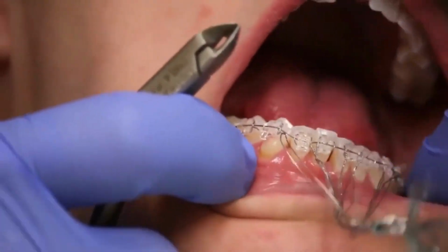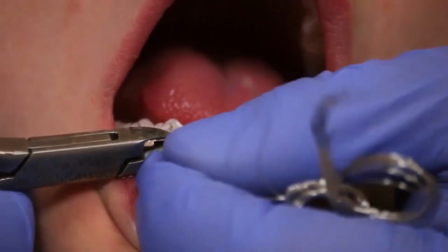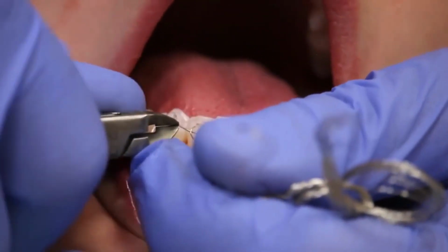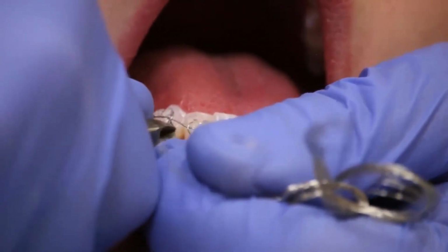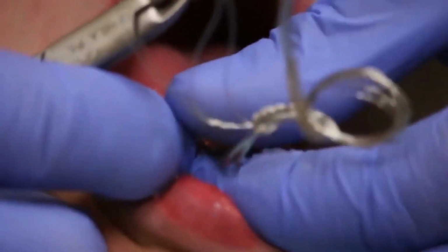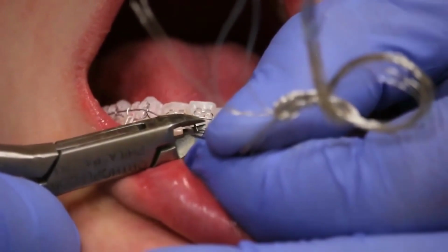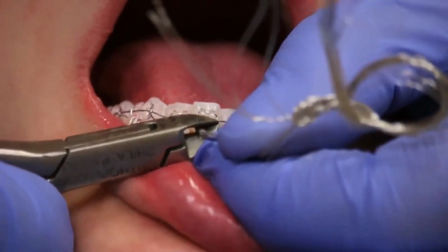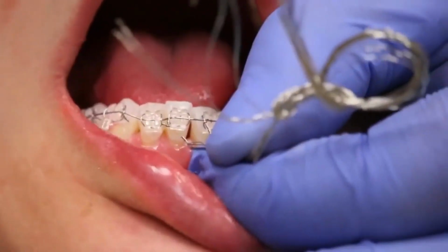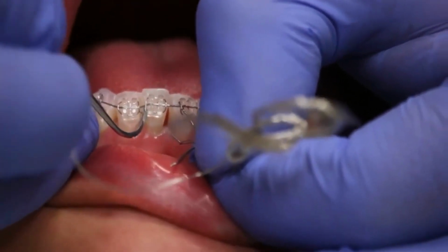Make sure that your pigtail is not very long, maybe 2-3 millimeters, so it doesn't end up poking the patient's gum. You want to push that pigtail against the tooth towards the contact so the patient can brush. Now I said can floss. I said towards the contact, not into the contact. So we cut the ties short, maybe 3 millimeters long, and we push it towards the contact, nice and tight against the tooth.